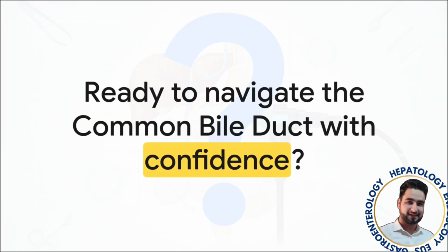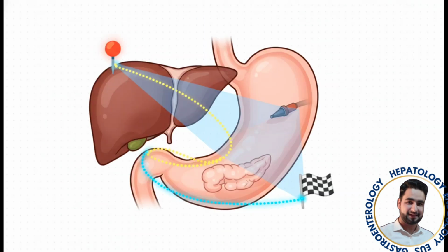So, the big question is, are you ready to take a procedure that can feel a little tricky and turn it into something you can do with absolute confidence every single time? My goal here is to give you a clear, actionable guide that you can run through in your head and then take with you into your very next case. Let's get started.